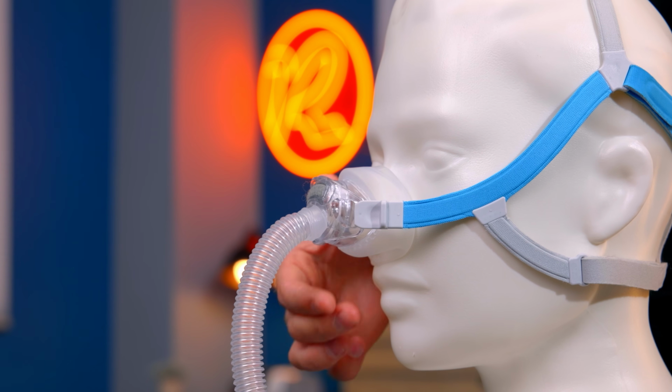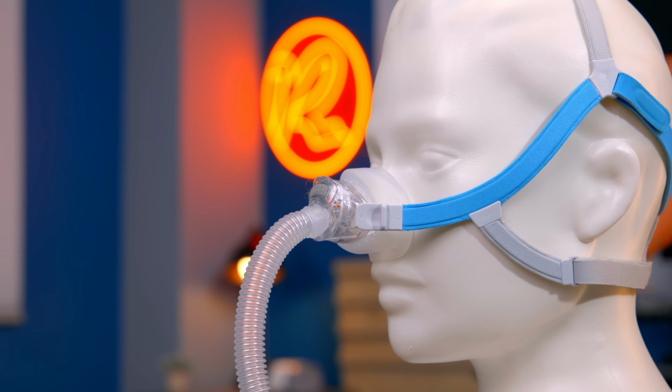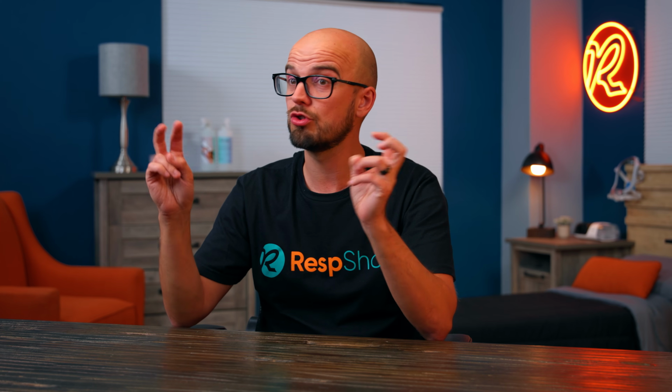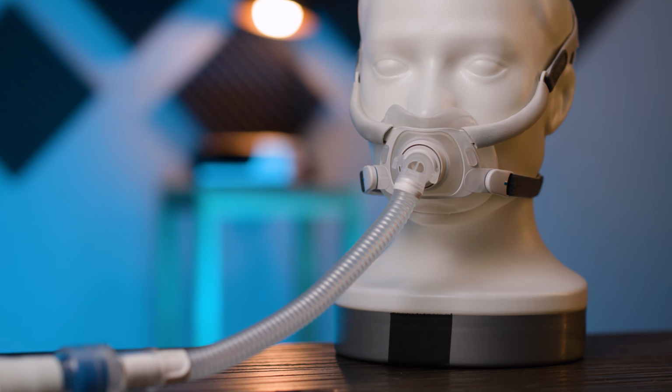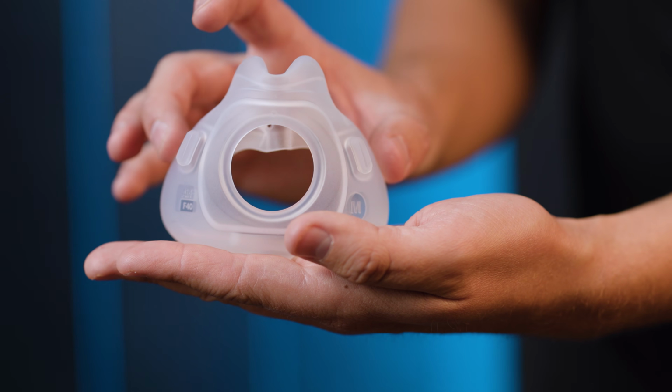Now, some masks have extra soft silicone or gel layers that naturally mold to broader noses. Look for masks marketed as Adaptive Seal or Ultra Soft Cushion, and make sure that you use the right cushion shape for your nose. If you have a wider nose, make sure that you use the wide size cushion. The ResMed AirFit F40 could be a good option for you, and it has small and wide options for a cushion.